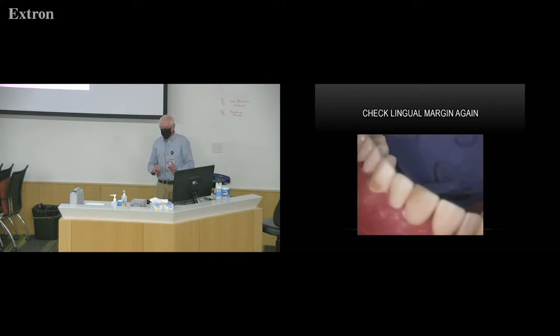So what's the patient going to think every time they run their tongue over your restoration and they feel a discrepancy? Are they going to be real excited about referring other people to you? No, they're not. But if they run their tongue over it and it's just as smooth as glass, they're going to tell everybody what a great dentist you are.